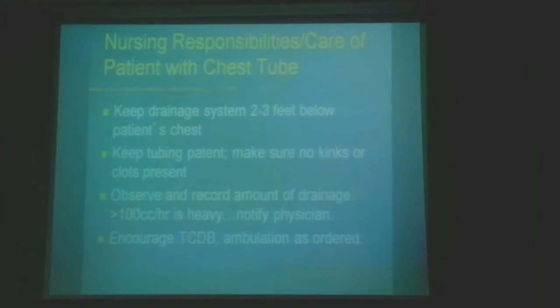You are right. The tricky thing is that when we put in a chest tube, we put it obliquely like this, and then we put a dressing. Some chest tubes are inserted like this. And when you put the dressing, what will happen? It kinks inside the dressing. So try to put some gauze below the tube.